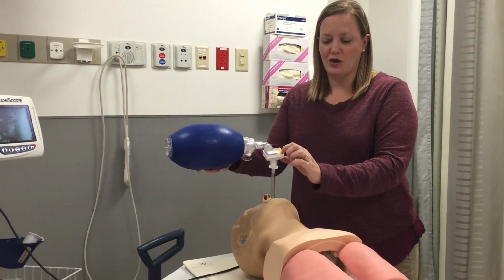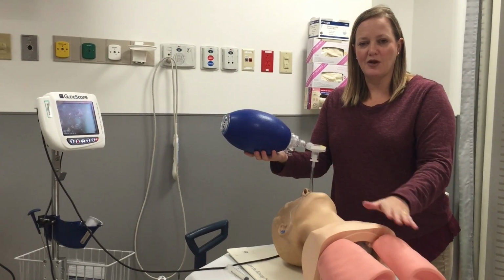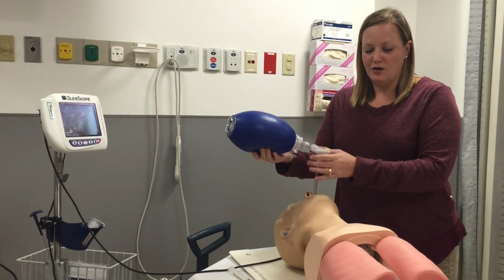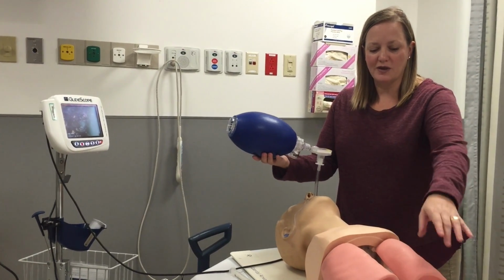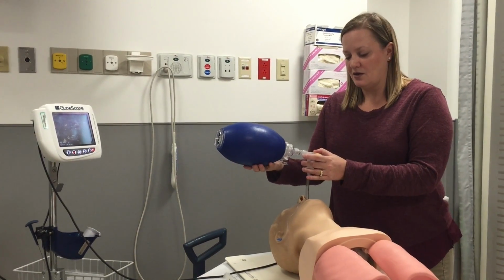Again, you will be watching for color change in the CO2 detector, and also you will be listening to the patient's lungs to make sure that you have equal breath sounds on both sides. You will listen to both lung fields, and then you will listen over the epigastrium to make sure that you have not intubated the esophagus.